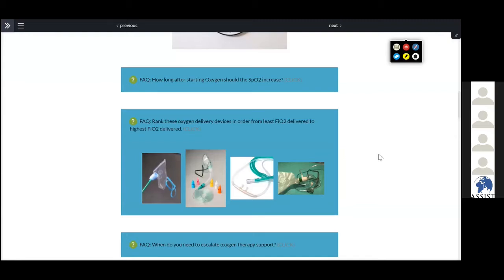Yeah, I like the message from Oscar saying if the SpO2 is below 90 with maximum flow, you will refer the patient to ICU. And the message from Emmanuel, if the saturation is below 94, you need to consider giving oxygen. The other thing I can add, once you have reached a saturation of 96, you may consider decreasing the flow of oxygen you are giving. Okay, I think that's good.